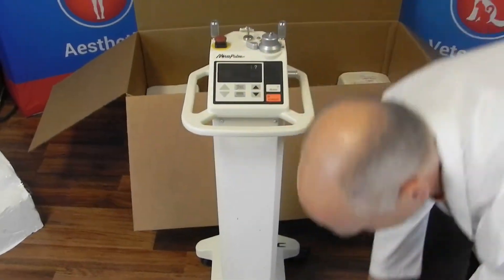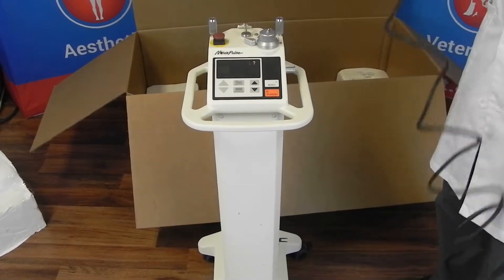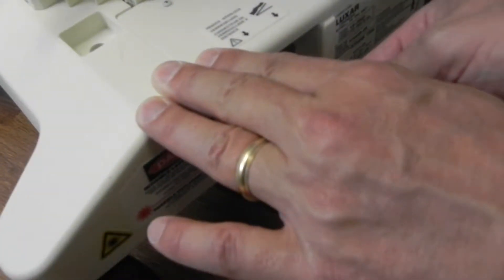So now you've got your laser. Your foot pedal — just uncoil the cord. It has a plug that'll go in the back of the laser. There's a little foot pedal plug right here; just plug it in until it clicks.